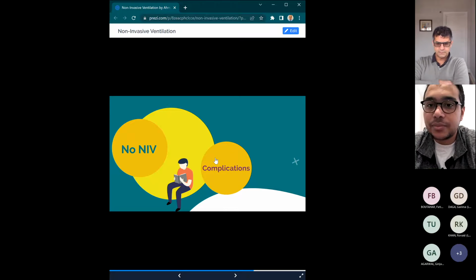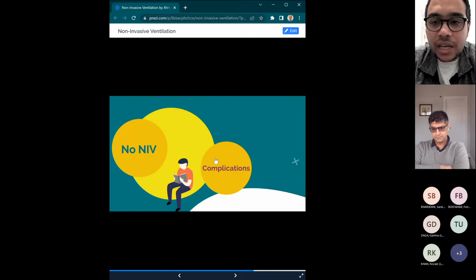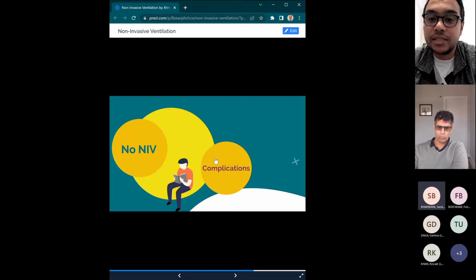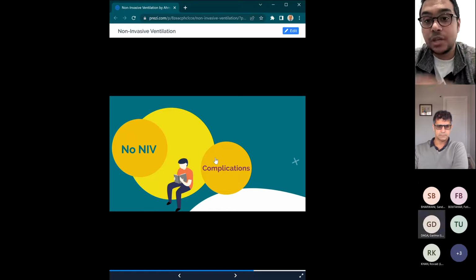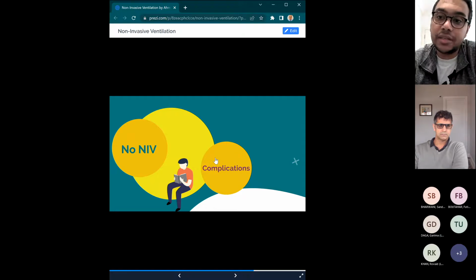Ahmed, there could be injury. Yeah, there could be aspiration, injury. Those are the main ones. Yes, injury. What injury you mean? Like lung injury? If it's not a well-fitting mask, you can get pressure sores. Exactly, injuries, thank you, around the nose. And facial injury is one of the things, especially pressure ulcers. What else? And yes, you said the aspiration part. Patients on high flow, like high pressure flow, can swallow this air, and that might cause aspiration, especially if they are confused. What else?